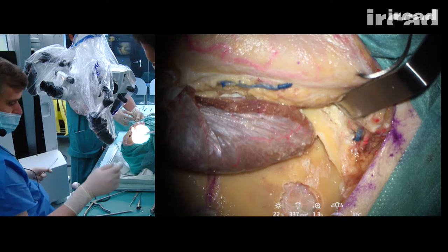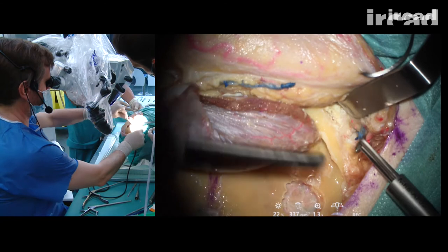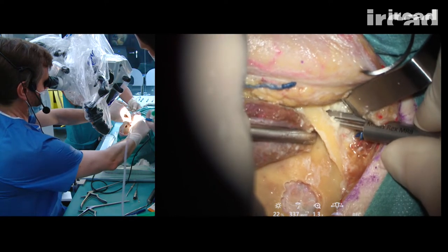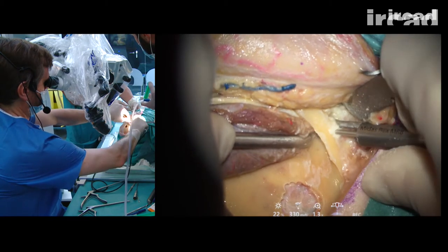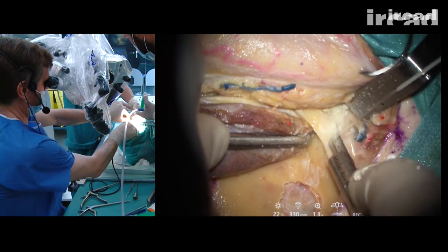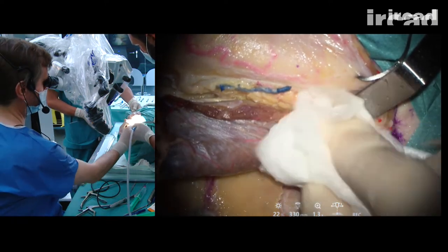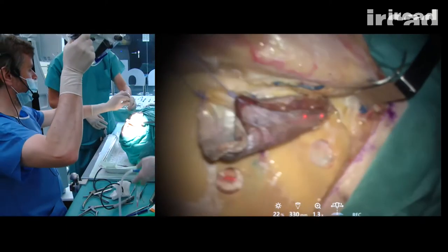Okay. And we can start to do the first bone cut here, placing the B1 foot plate here, and oblique cut posteriorly. Okay. So the first bone cut is done over the zygoma.